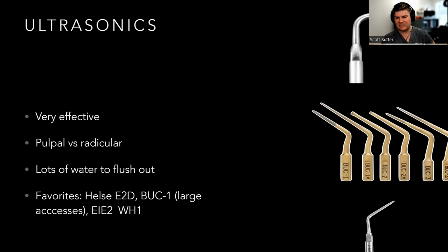EIE makes this nice little workhorse one as well. It's available both with and without diamonds. I tend to like this angle better, but I know a lot of people like this angle here. So I own a ton of ultrasonics. I use this one like 99% of the time, but I own probably 100 because every now and then you need a different angle.